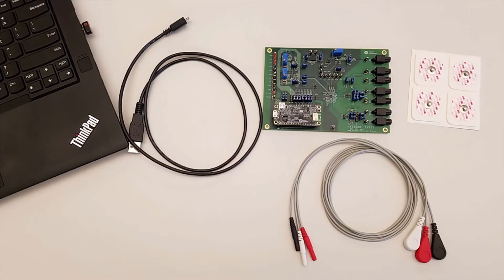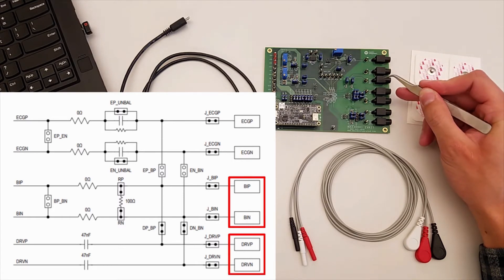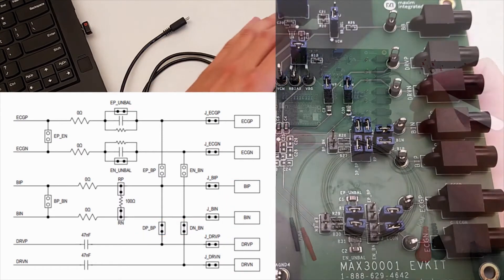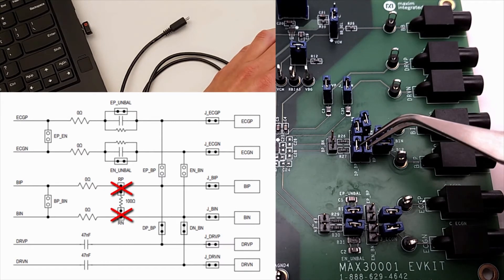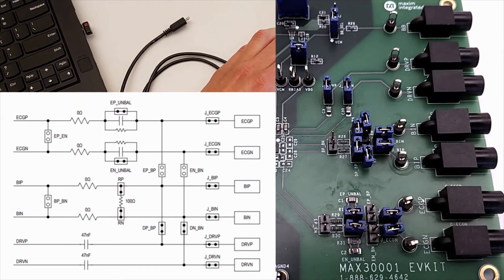Next we need to connect the hardware and configure it for two-lead measurement. For two-lead measurement we'll use the BIP and BIN ports on the board, with the DRVP and DRVN ports connected via the onboard jumpers. Next to these ports you'll see a cluster of jumpers, and you'll need to remove the RP and RN jumpers to disconnect the 100-ohm test impedance. I'll place the jumpers on one of the pins for safekeeping and leave the rest of the jumpers in their default configuration.